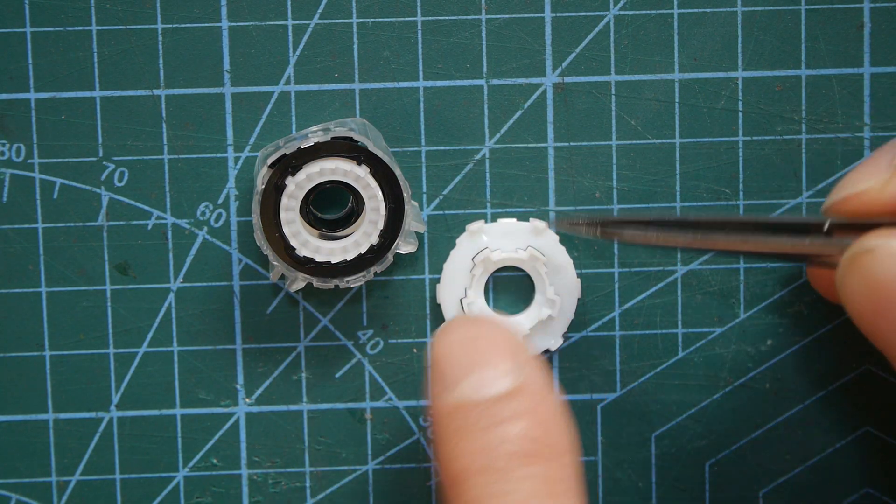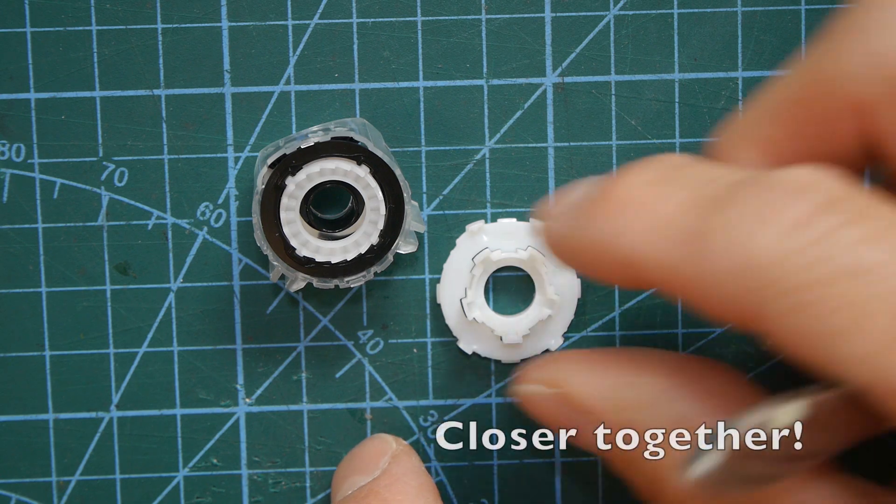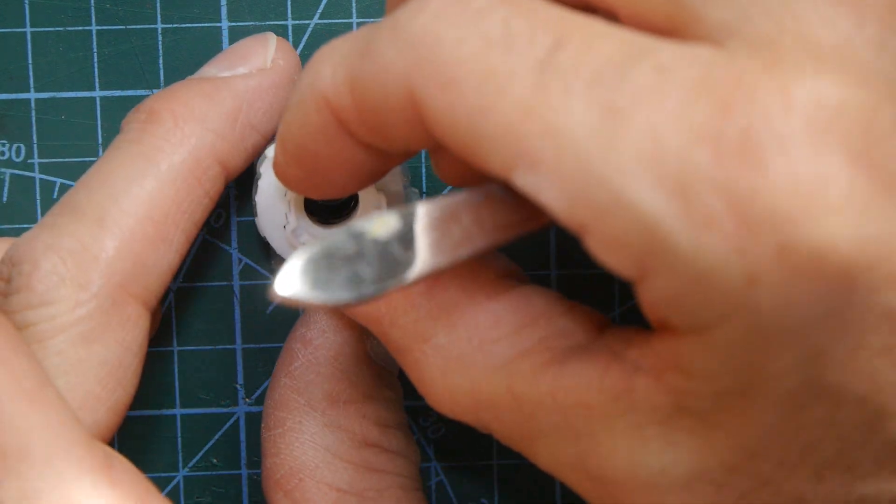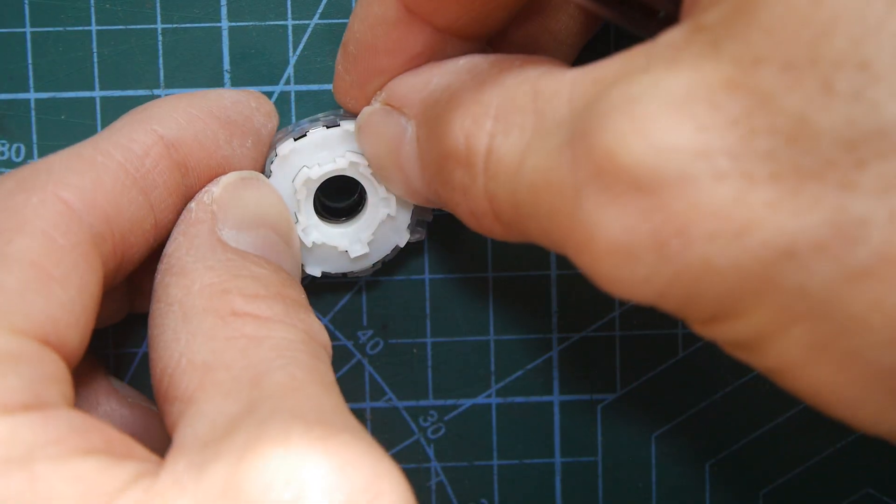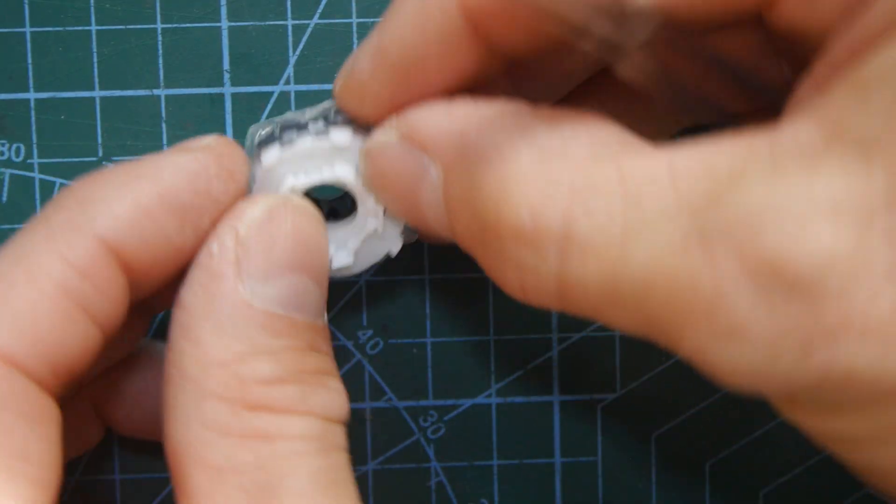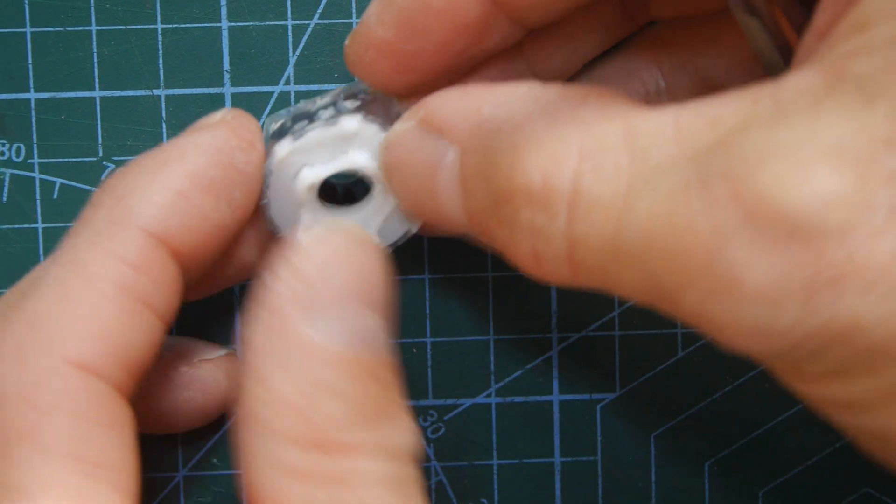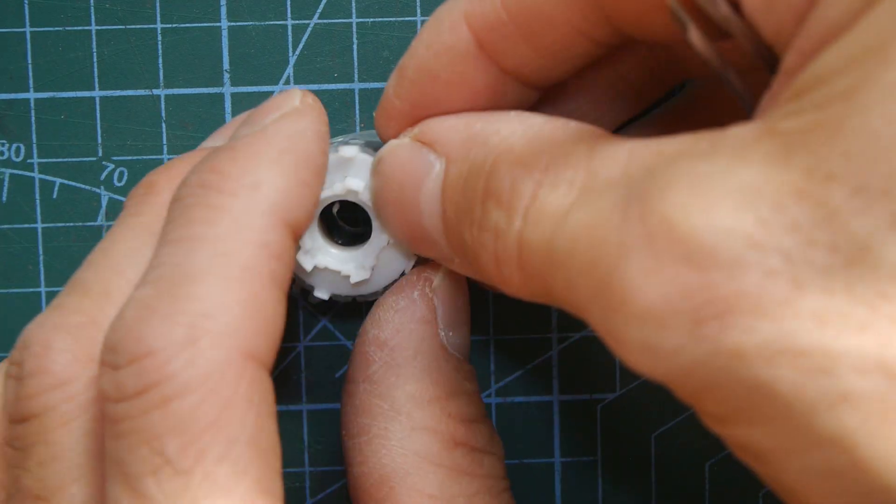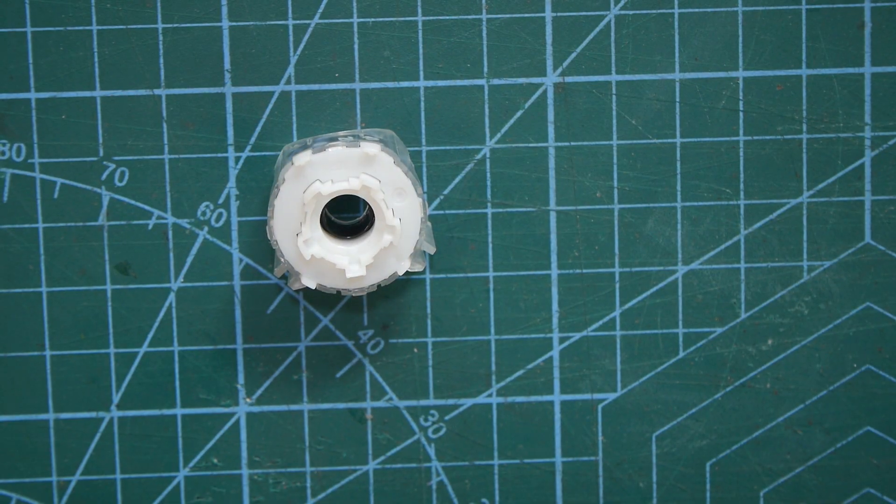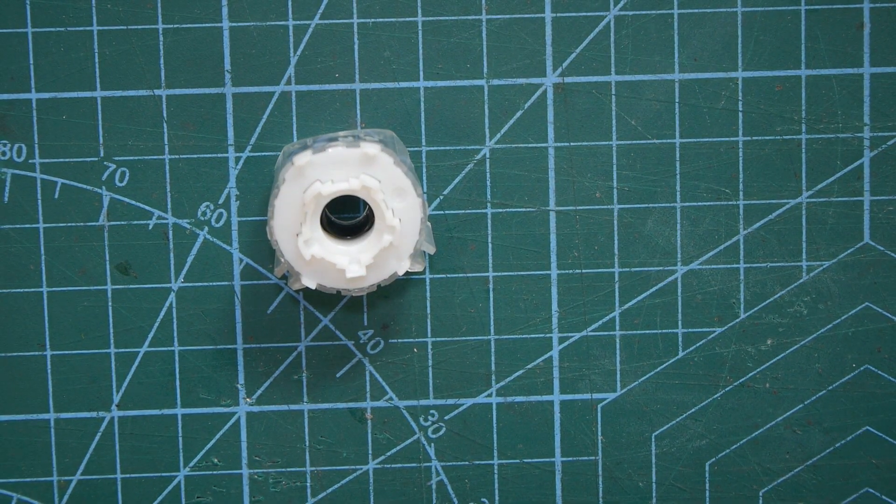So let's see if I can put it all now back together. Interestingly enough this has to go in exactly the right way because these two tabs here are further apart than those. This must all be put together by a machine in the factory it's really clever.